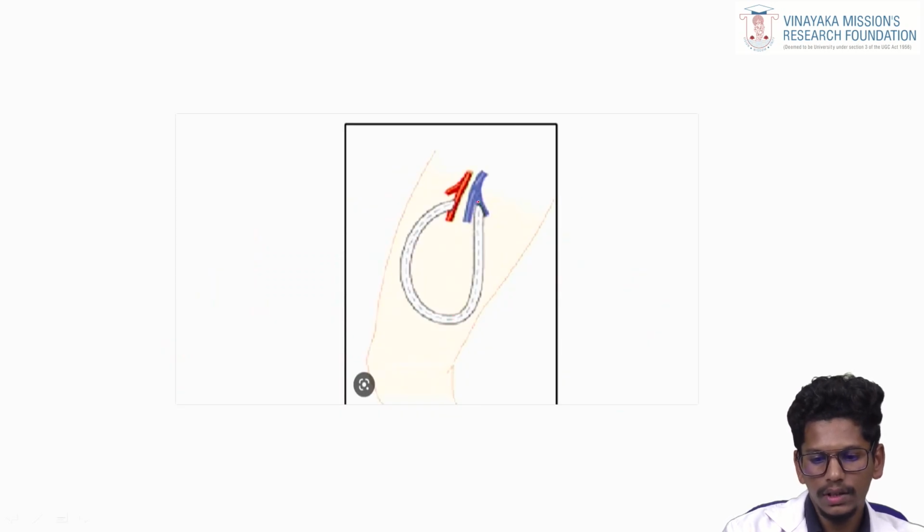And last, this is the thigh graft, where they place PTFE material in the thigh. This works like a bridge which connects an artery and a vein.